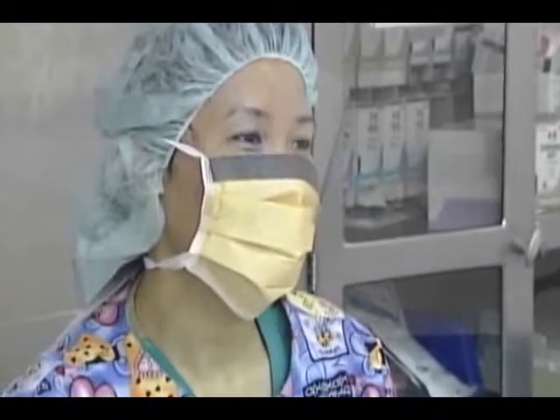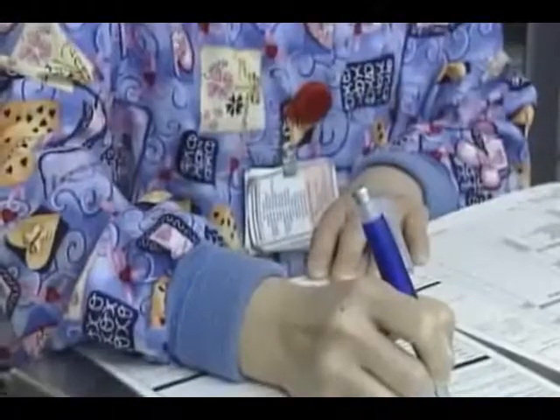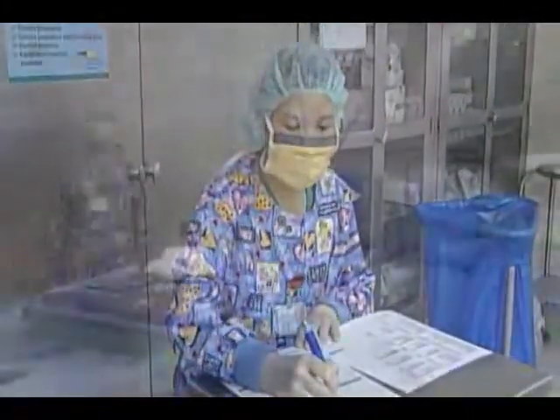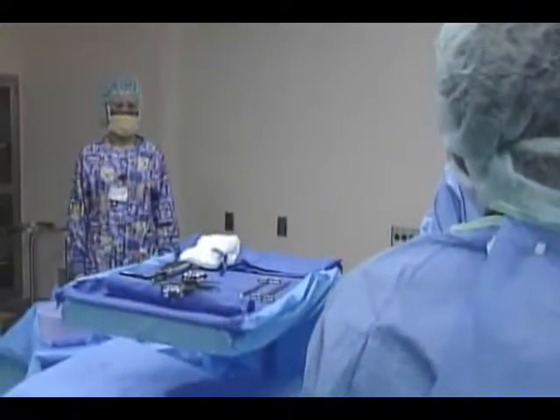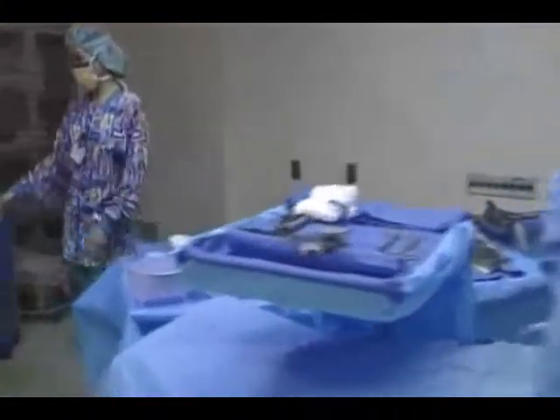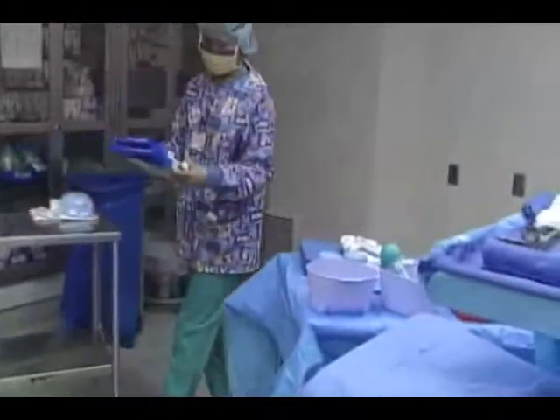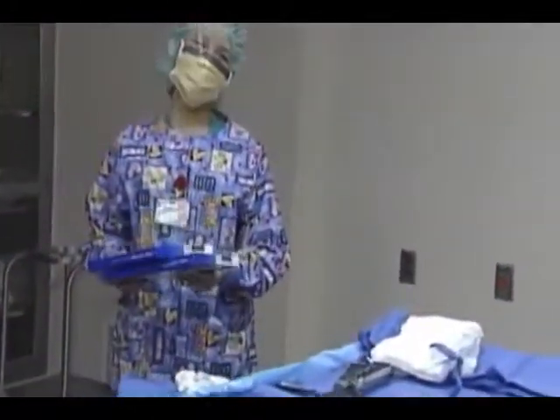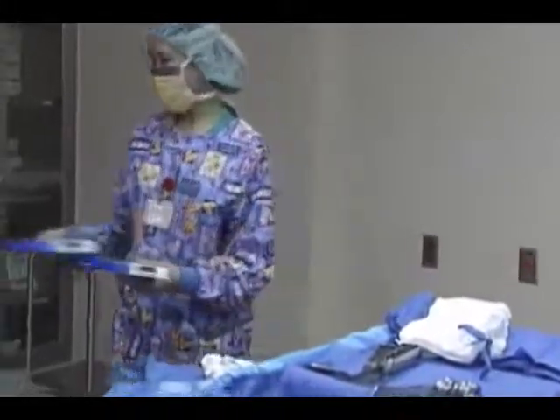We're going to have a frozen section soon. Okay. Dr. James, you ready for the mesh? Yes, I am. I have 6 by 3 or 12 by 12. I like the 6 by 3 mesh, please.